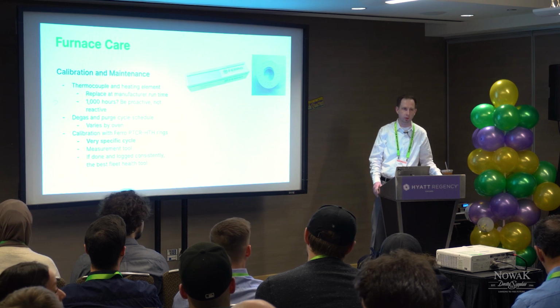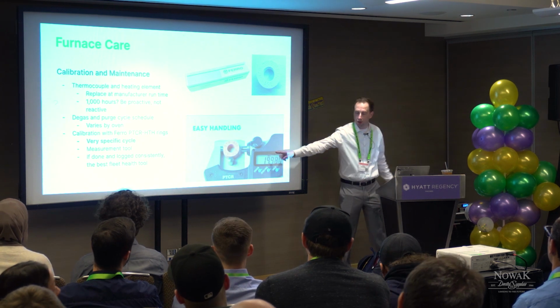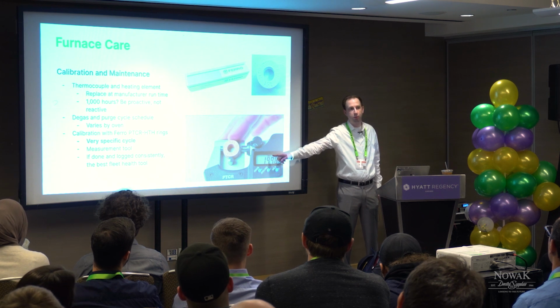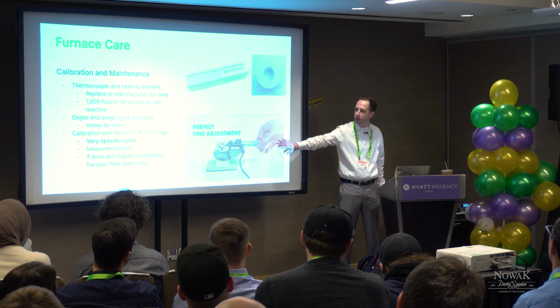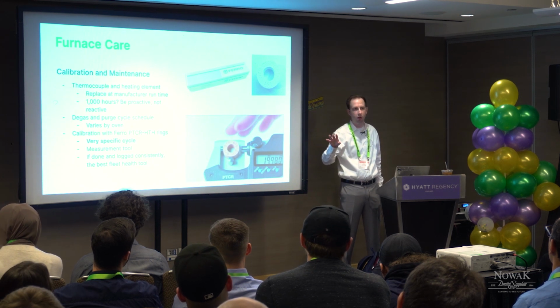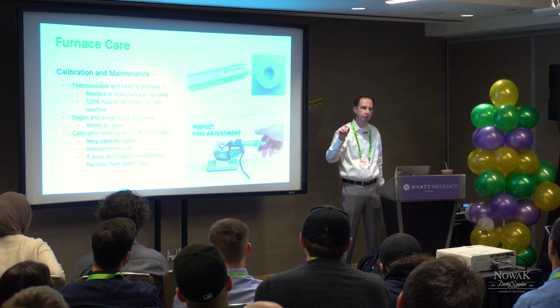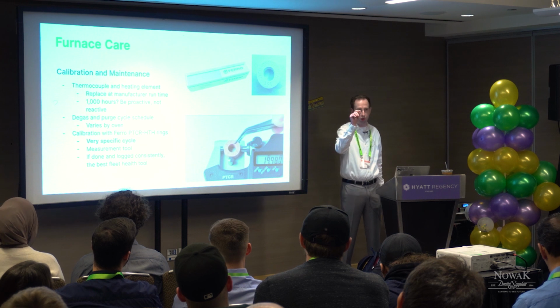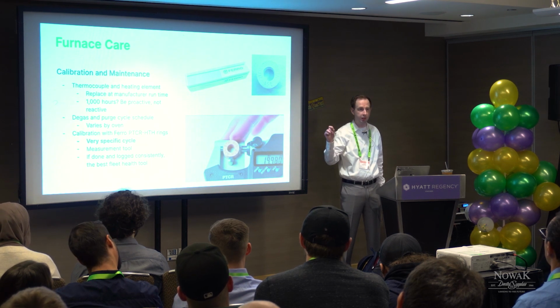Should you use that specific caliper too? I would recommend it. This thing with the fixture, it's not cheap, it's 800 bucks. But worth the money. And this process, although it's a full 12-hour cycle, it stinks taking a furnace out for that long. If you did this across your furnaces once a month and log those temperature hits, you can actually draw a curve, and over time, you can see your fleet health.